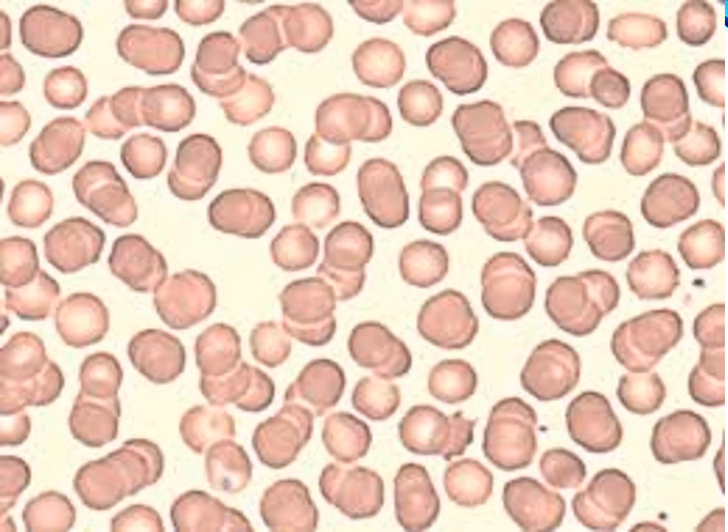And again, this is what red blood cells will look like, taking up the red stain on a blood smear. Some of these are overlapping up top here, but they all seem pretty normal. There is, I would say, some poikilocytosis down here, which is basically different shape. You can see this one has some burred edges, but for the most part, all these cells are around the same size and look normal.